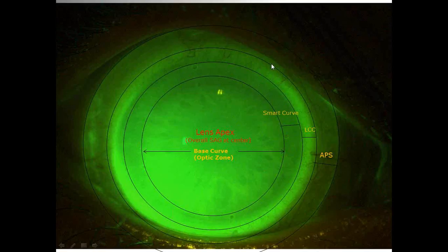Sure. I think that when the lids are in their natural position, it's going to be common to see that thinning of the fluorescein superiorly, just as a factor of the upper lid pushing the lens into an inferior position. There's been plenty talked about at meetings and lectures on scleral lenses that if you've got 1 or 2 clock hours where that fluorescein is thinned out, that can be acceptable. The thing I like to do is pull the lids back out of the way and get the lid tension off the contact lens and then really reassess that fluorescein again. If I still have decentration, which looks like it's creating a superior thinning of the fluorescein, we want to assess again, do we need to go with a toric APS, because typically a toric APS will give us a better centered lens.